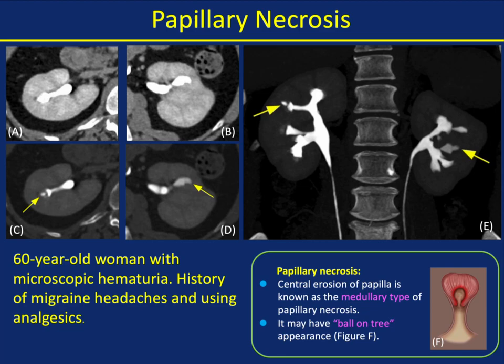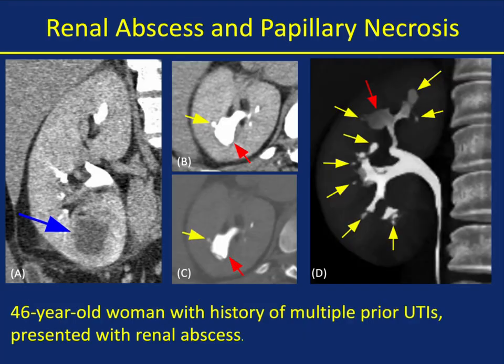Here's a patient with a history of migraine headaches and analgesic use. This is papillary necrosis with the central type of papilla erosion, known as the medullary type — that ball-on-tee appearance, like a golf ball. You can see it in one calyx or in multiple calyces, very nicely shown in this example where both kidneys are involved and multiple calyces.